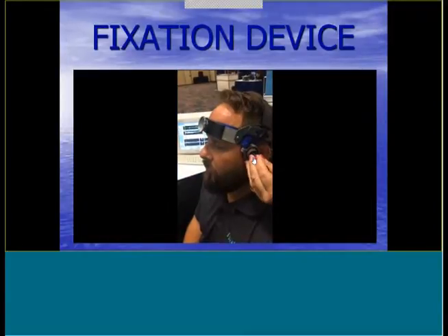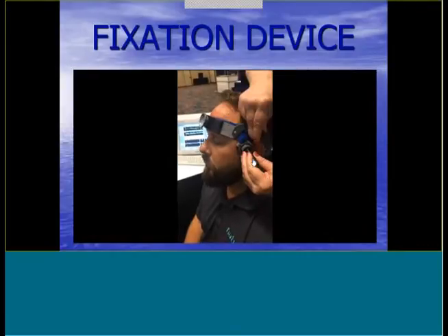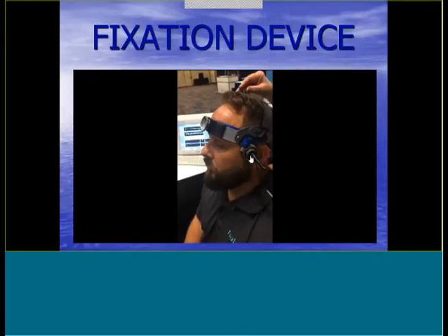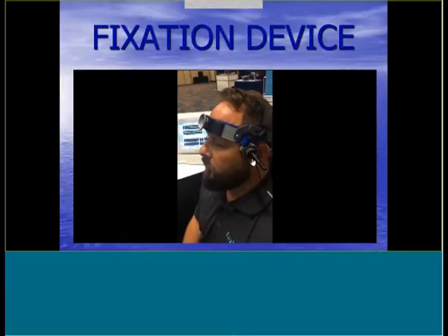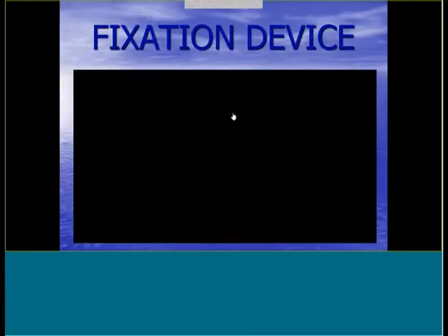Now, if you are monitoring in the operating room, you're going to want to pop that joystick off. For just regular monitoring, say you're doing a PFO or emboli monitoring, you can leave these on. But in the operating room, they get in the way because, remember, they turn the patient's head and that thing is sticking out.